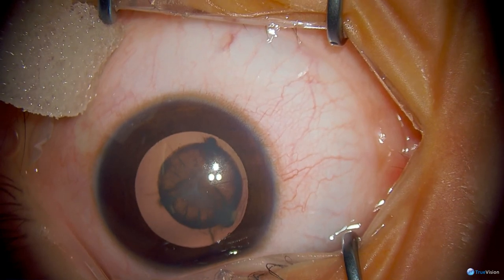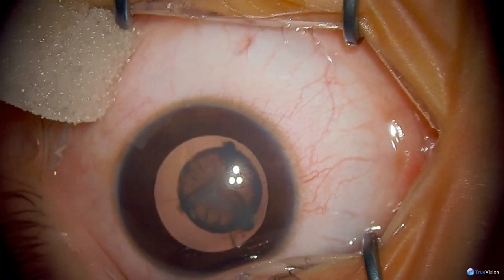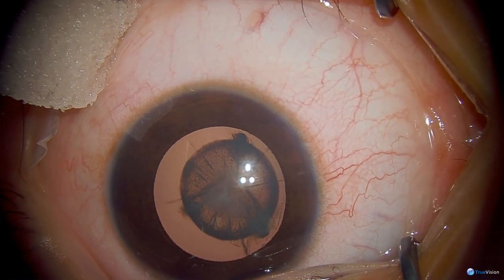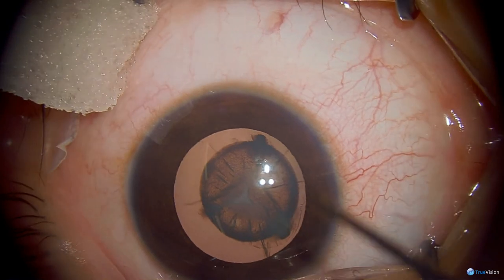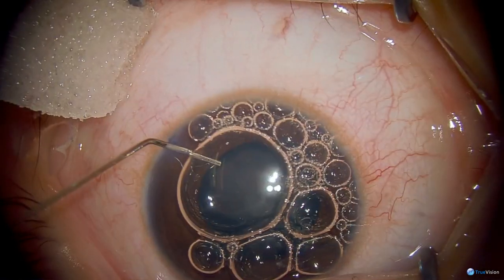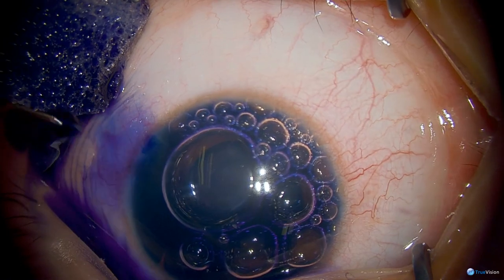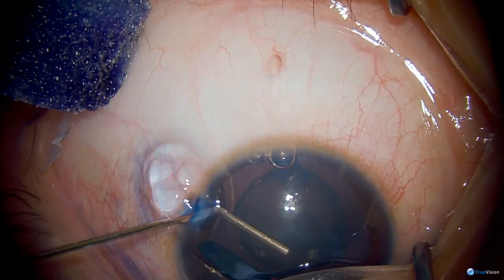As you can see at the beginning of the case, we're making a small secondary incision to allow us to inject air and some Tri-Pan Blue for capsular staining. This is being used because the capsulorhexis is going to be right over the area of the nuclear cataract. Frequently, that shadowing leads to difficulty with seeing the rhexis, as they are almost equivalent. Some capsular staining has been done and irrigated from the anterior chamber.